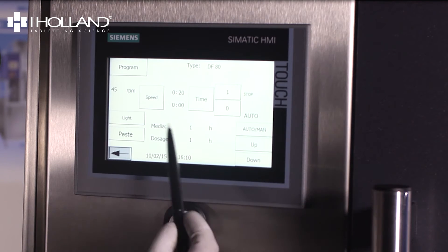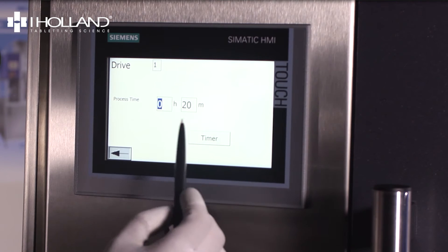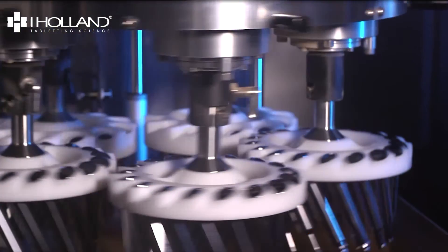MF polishers are particularly intuitive as they count the recommended limit on the media and paste. Warning messages will appear when either of these requires changing. To start the machine, press the on button.